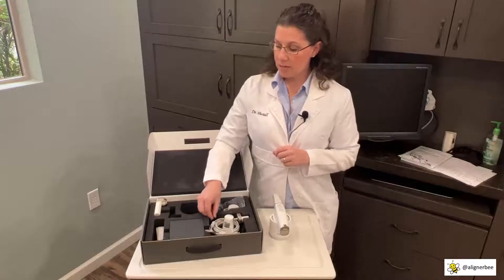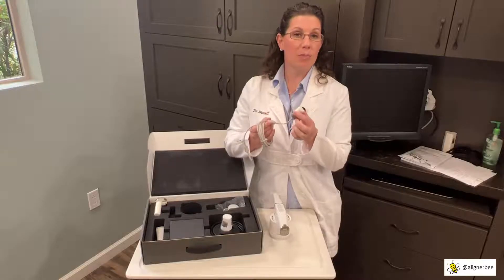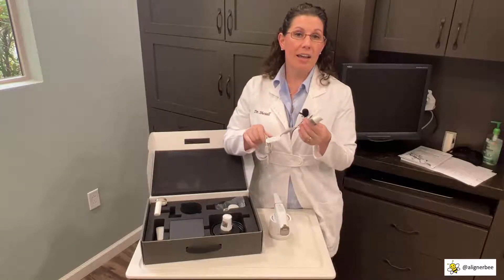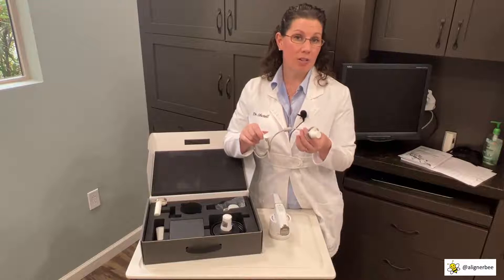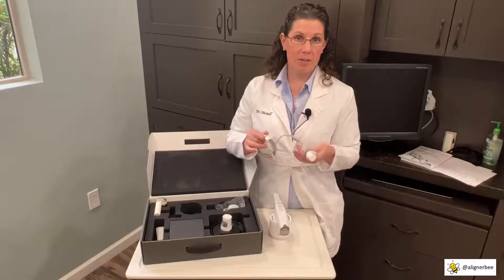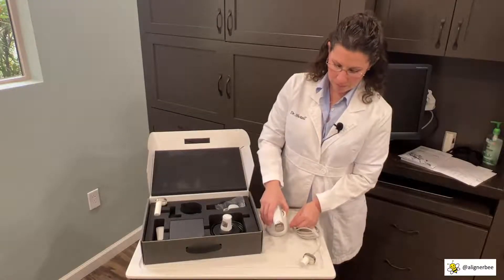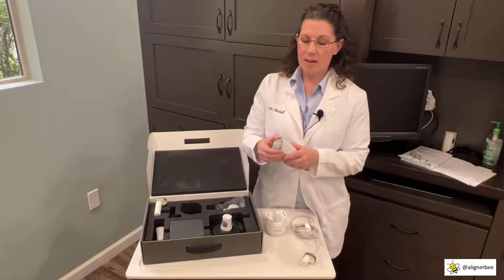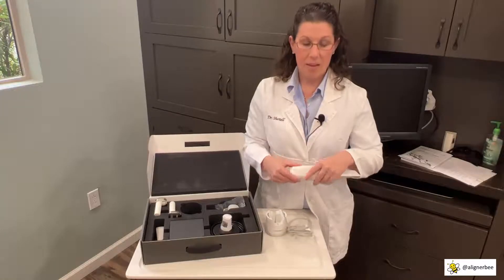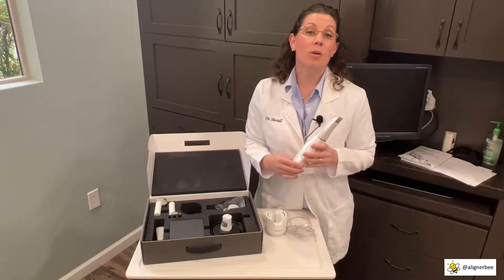Among the other accessories included with the scanner, there is a battery attachment with a power cord. This can be used if someone in the office has forgotten to recharge the batteries, so you're never without your intraoral scanner even if the battery is not charged. It is plugged into the side of the cradle and placed in instead of the battery, turning your wireless scanner into a wired scanner.